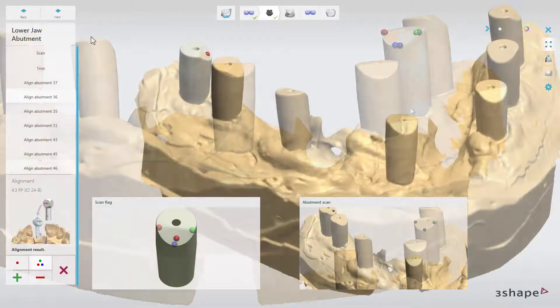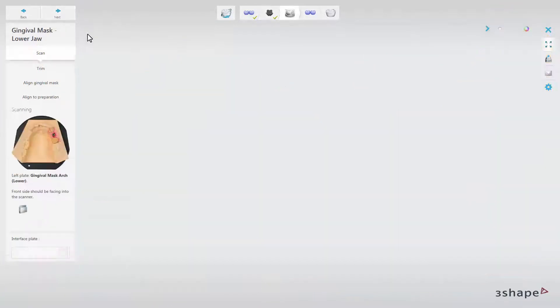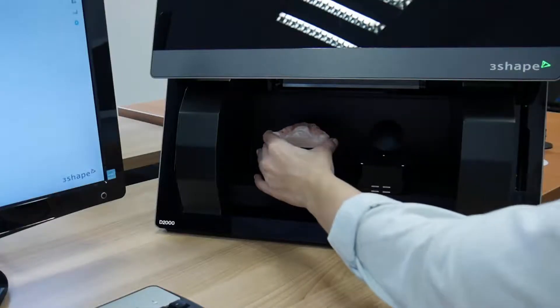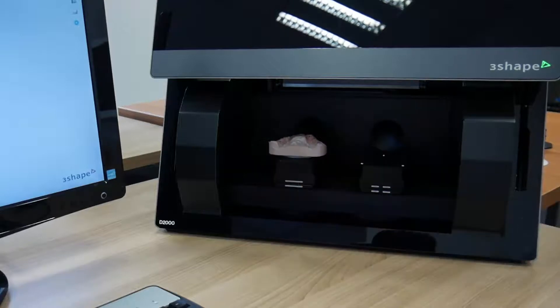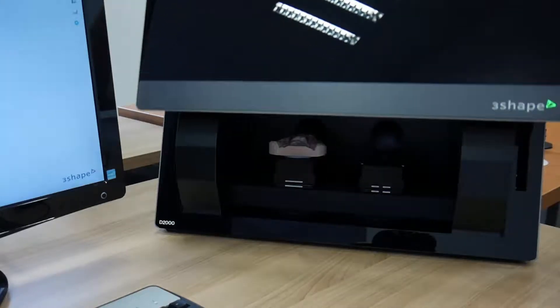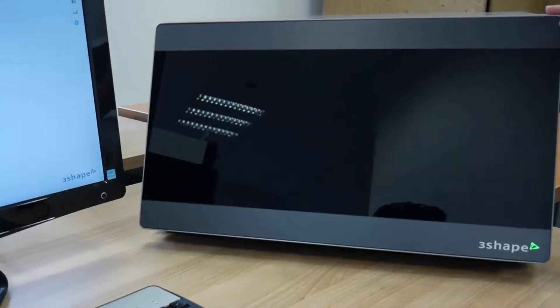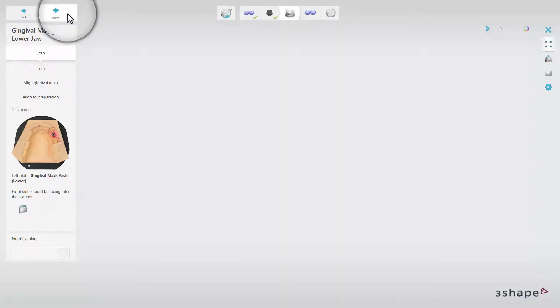When you are ready with the alignment, click Next to move to the Gingival Mask step. In this step, you need to scan a Gingival Mask. Take the model with the scanner abutments out of the scanner. Unscrew them and insert the model with a mask into the scanner. Close the door and click Next.